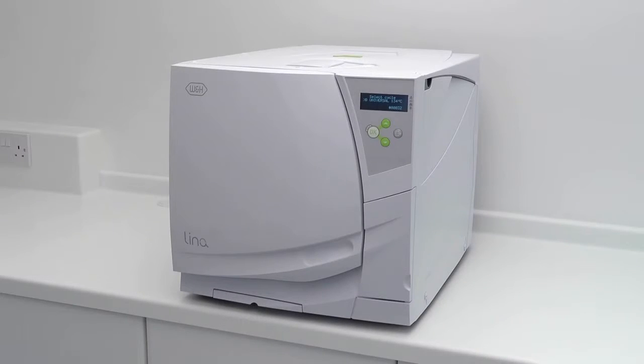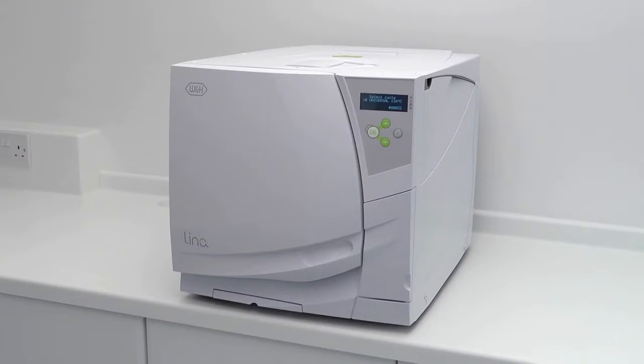Modern day sterilisers are all subject to various types of testing at periodic intervals of their life cycle. As the W&H Lina NB steriliser is classed as a type B vacuum, the correct weekly testing, as described within manufacturers and national decontamination guidance, is an air leakage test.